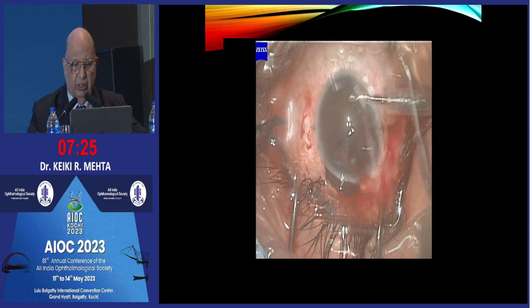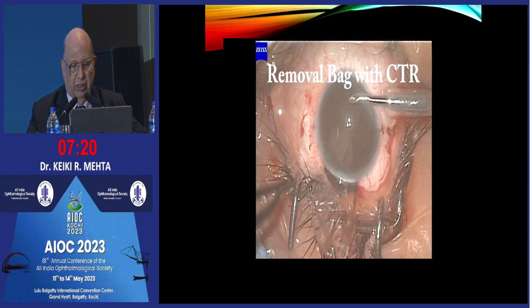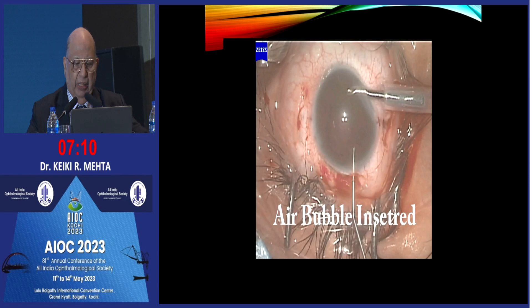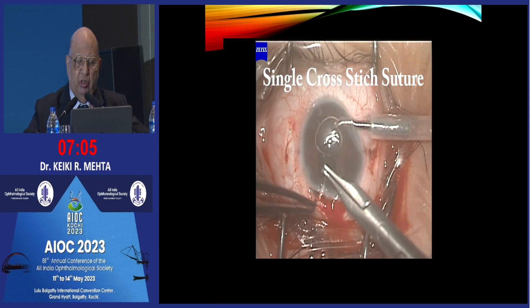We remove the IOL first and subsequently the bag follows suit — really the bag had no support. At this point you can cut off your infusion, and you will notice that the air bubble is going to go back. Insert an air bubble — very important. And the chamber is soft enough, so you put a single cross-stitch.